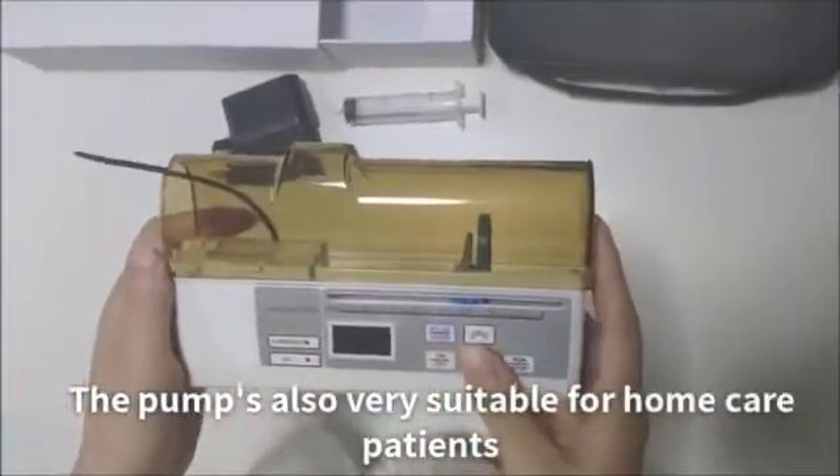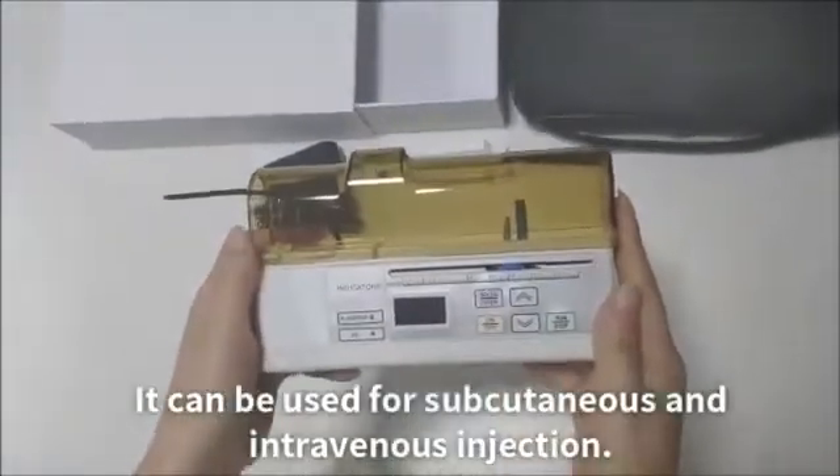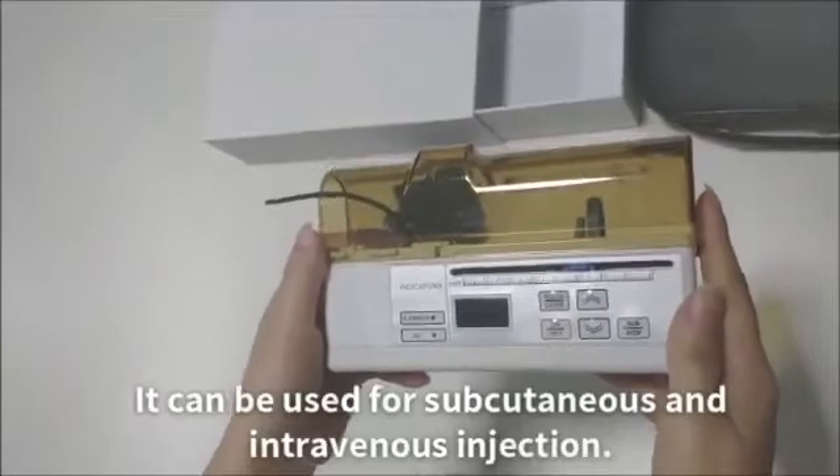The pump is also very suitable for home care patients. It can be used for subcutaneous and intravenous injection.